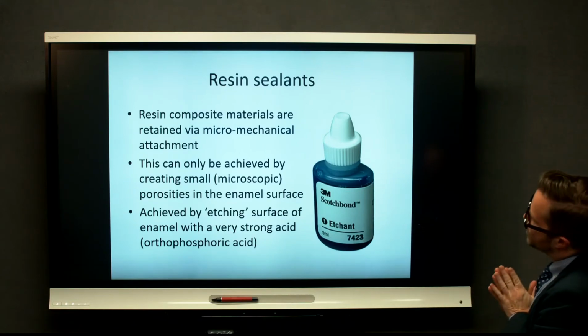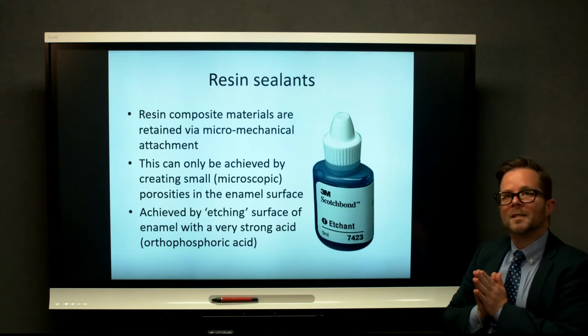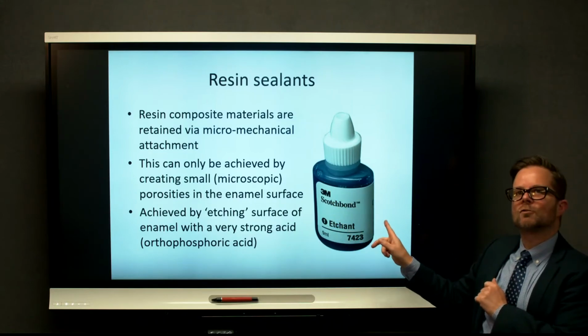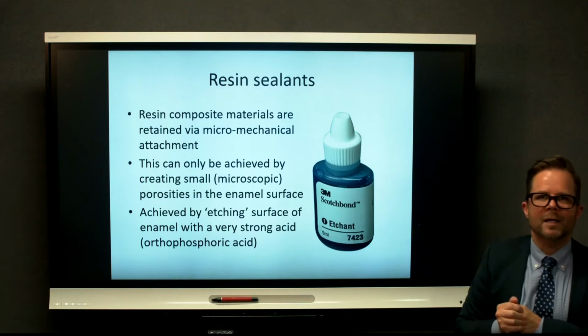Now, in order to produce the micropores, we actually need to demineralize the tooth surface, and we do that using a very, very strong concentrated acid, orthophosphoric acid.